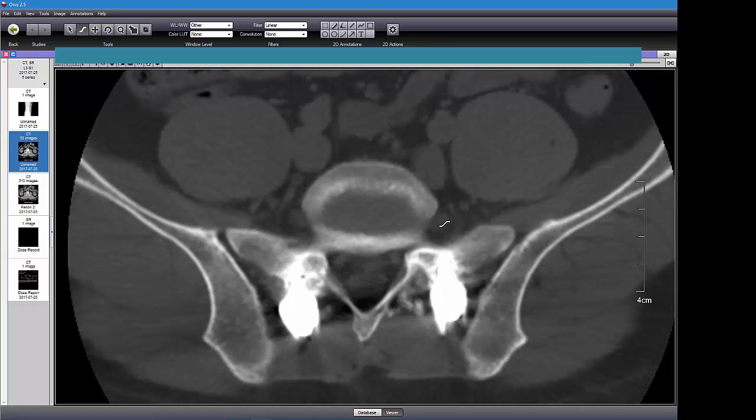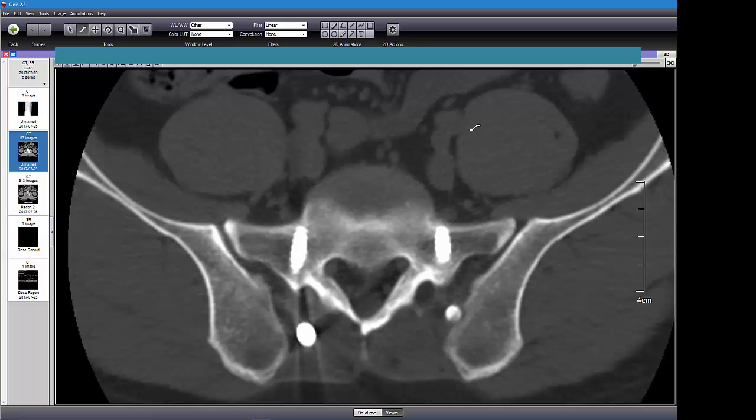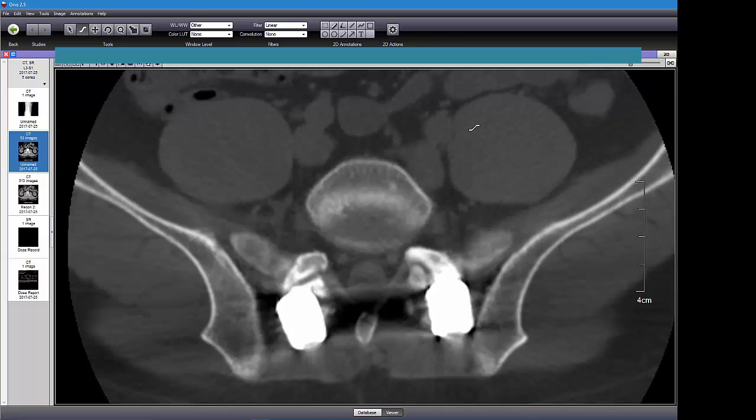Now we're coming to L5. Here's the psoas muscle. See the big psoas shadow? So right here, these would be the internal iliac arteries and veins here. And keep your eye on that one. That's the one that's going to give us trouble. Okay, so here comes the screws. Oops, we saw those screws already.